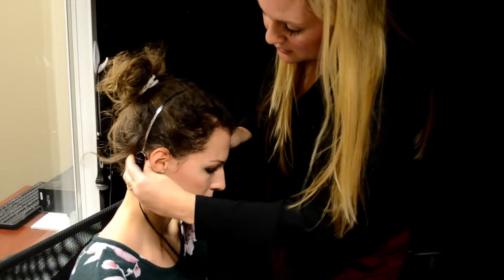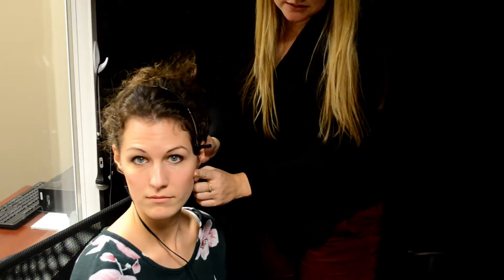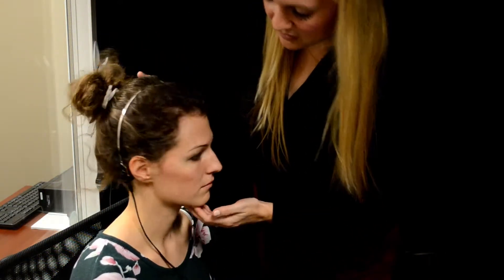The front portion will just be like that, and we've got good placement because we're not touching the ear and we're still on the mastoid.